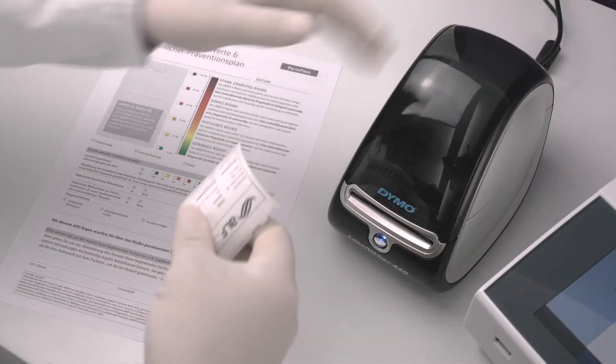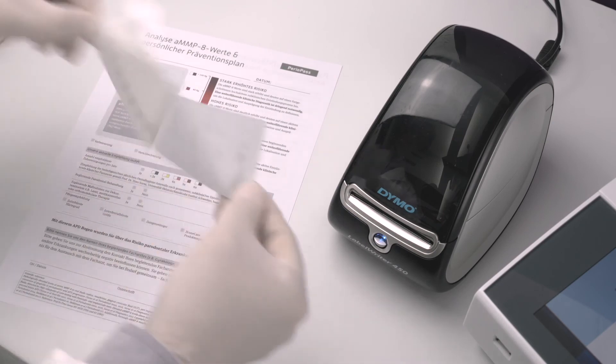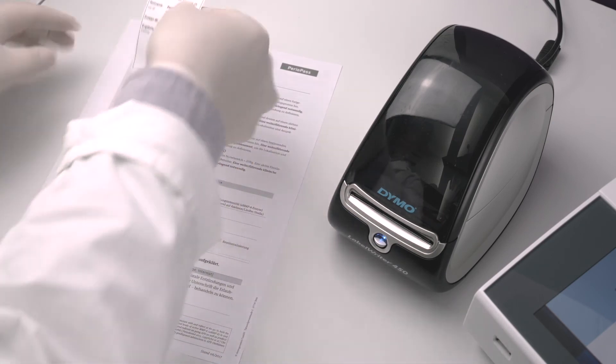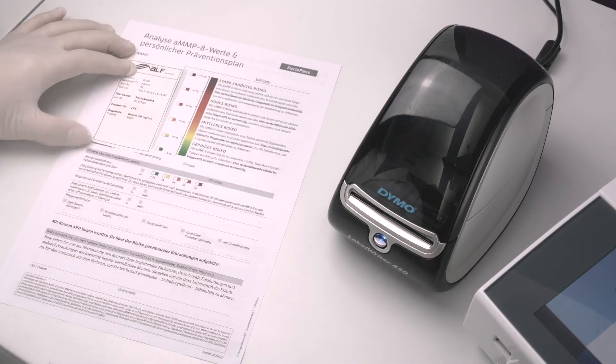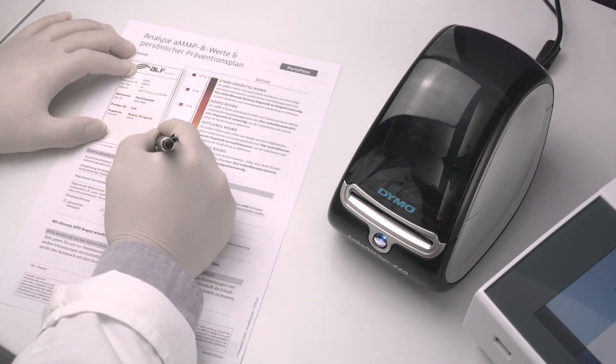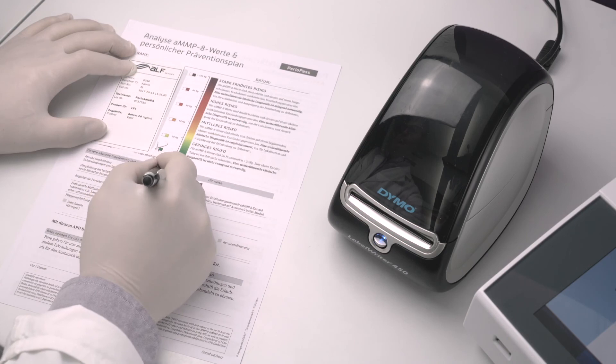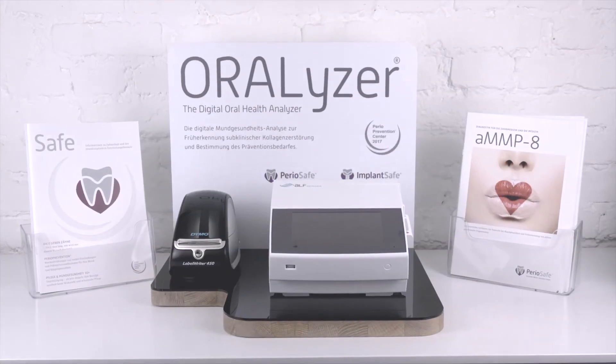A result of more than 20 nanogram per milliliter indicates that there is an elevated level of active periodontal degeneration occurring in the patient's mouth.